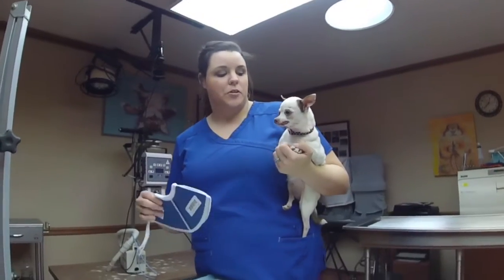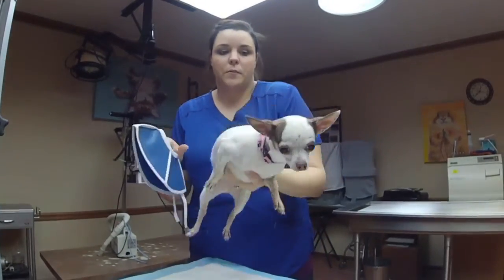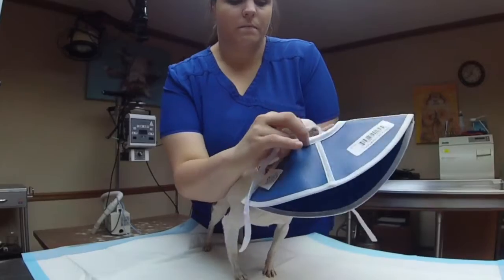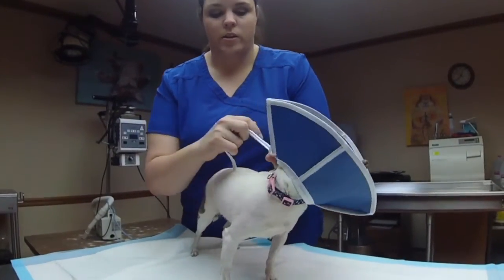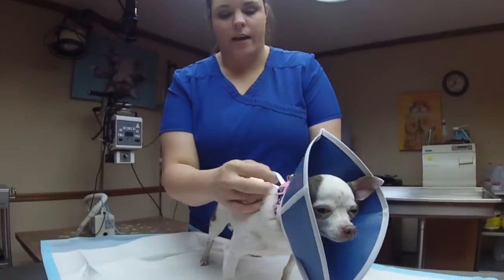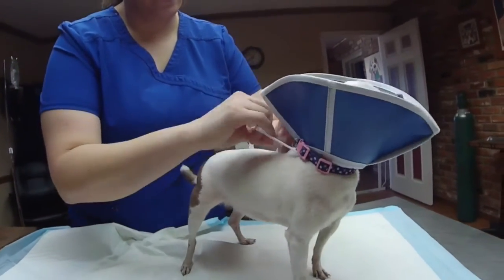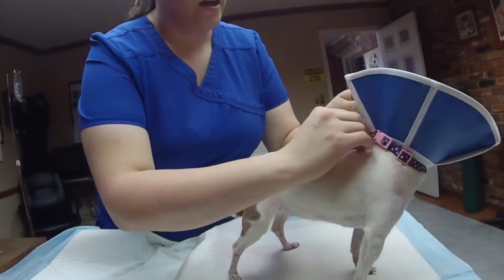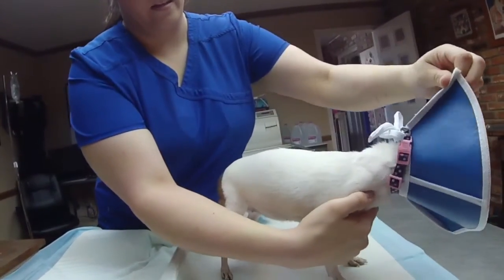This is how to correctly apply an Elizabethan collar. What you want to do is slip the e-collar over their head. And then you want to tighten this down and tie it. We always recommend tying it over a collar. That way they do not slip out of it. You want it tight enough that their head can't come out of it, but that they can still breathe.